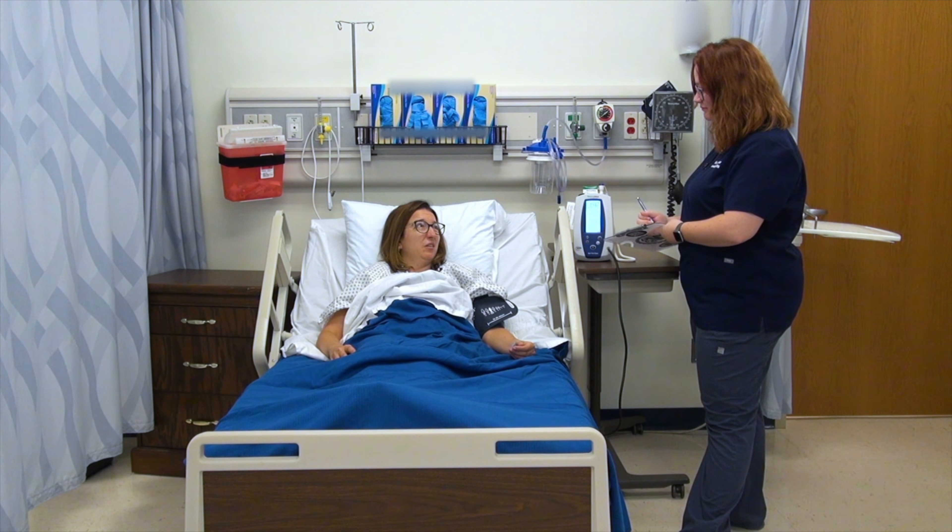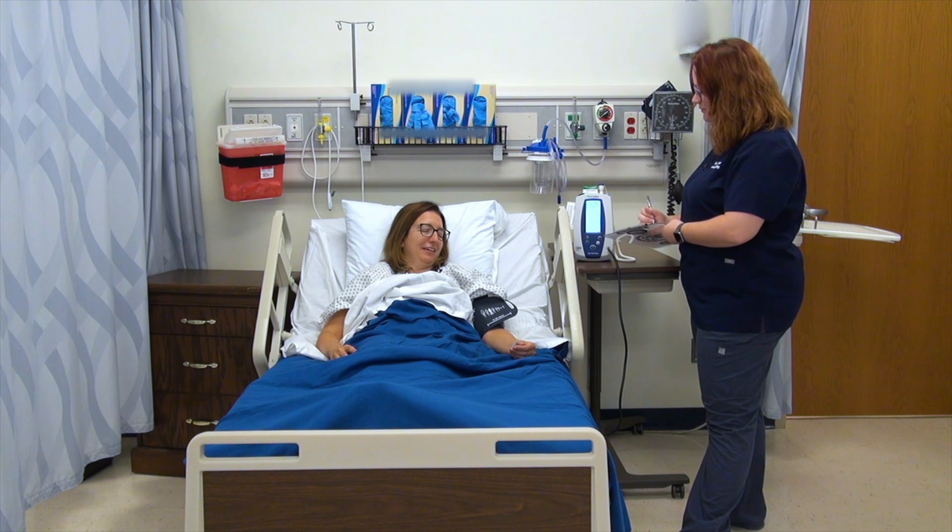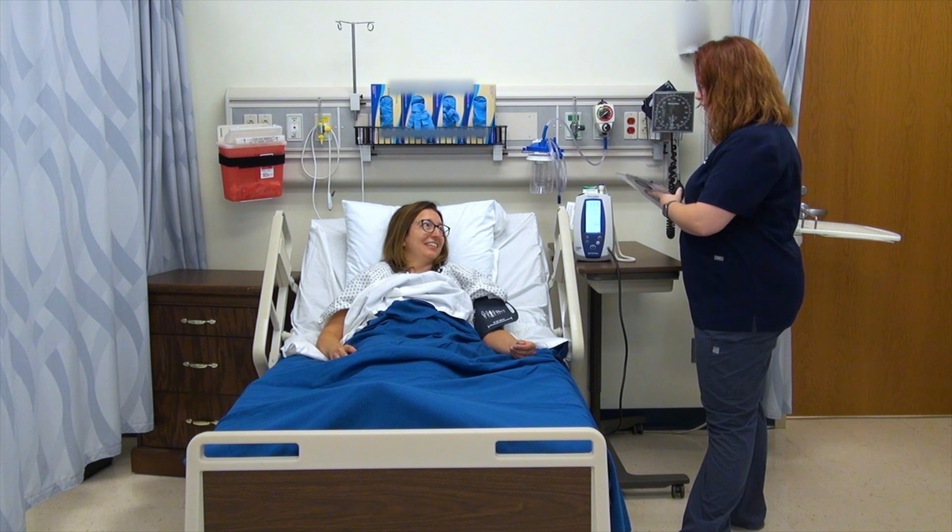Feeling weak or dizzy? A little bit. Well, we'll just take it easy and go slowly through this process. I'm going to make sure I document your blood pressure and your heart rate so we can see if there are any changes. It's 115 over 77 and your heart rate is 63.